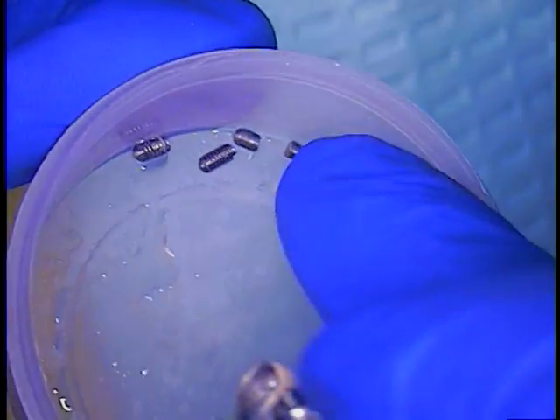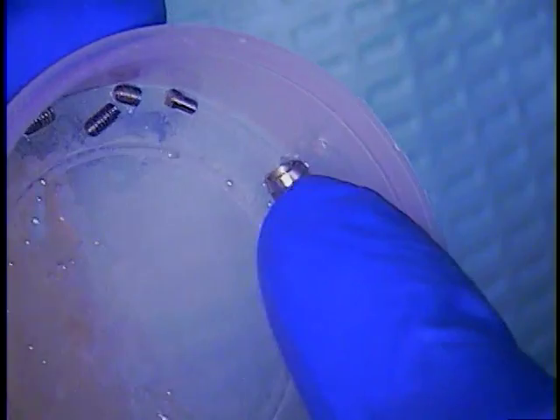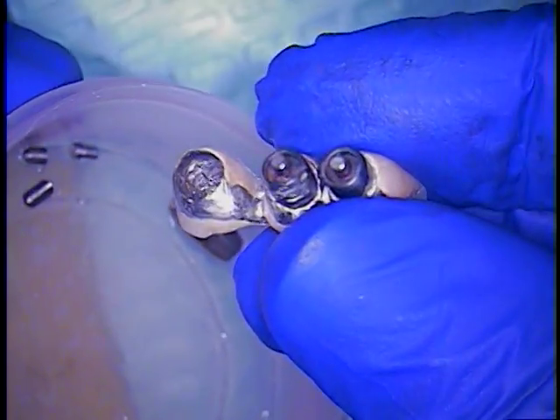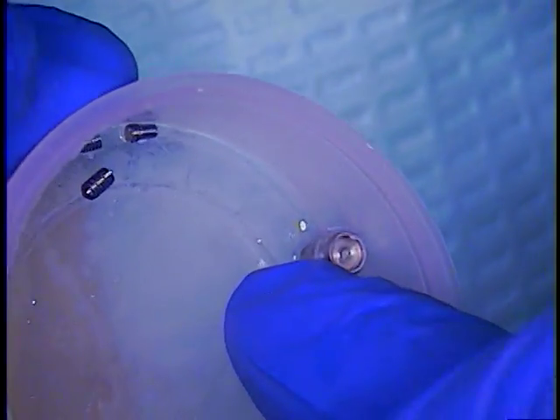If I was really smart about this, I would have noticed there is no shaft on that abutment — look at this here — and there is none on this abutment either. See that?